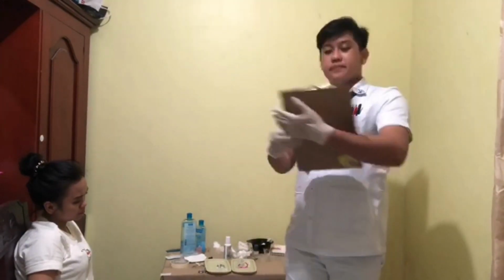Before starting the drug administration, there are general preparations we must remember to do. These general preparations are applicable to the 3 procedures we'll be performing. The first is to check the doctor's order. After that, check the medication administration record, or MAR. This is for us to properly check if the medication we have is the right medication ordered by the physician for our patient.